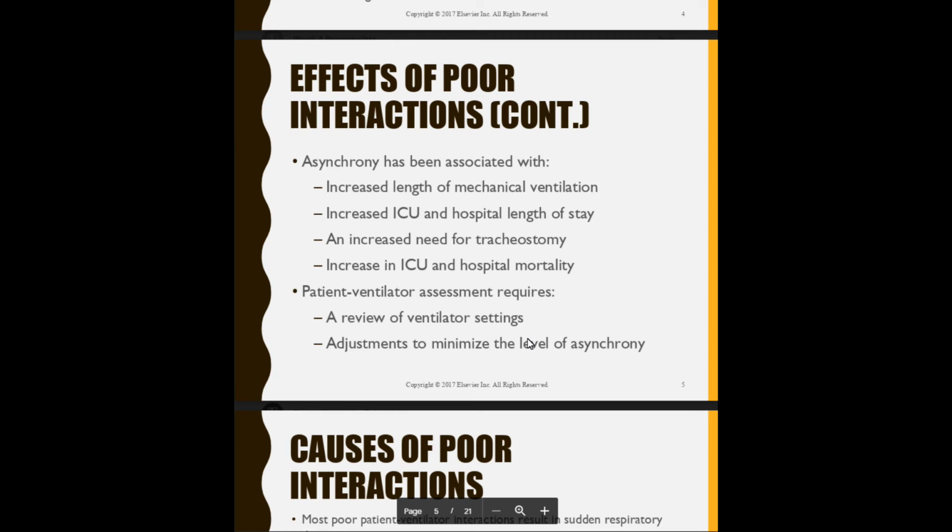So if you, as the respiratory therapist, cause the asynchrony so the patient has to increase their length of stay, your boss ain't gonna like it. The hospital's not gonna like it, because once they do an investigation, they found out that you set the ventilator wrong. Yeah, they're going to be yelling at you because you caused the money.